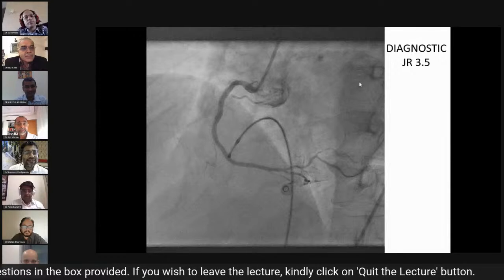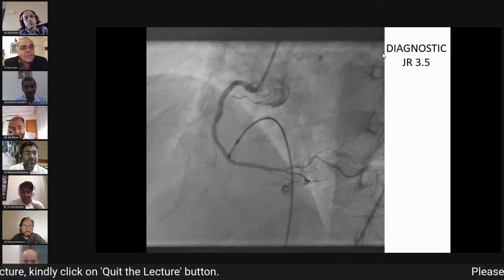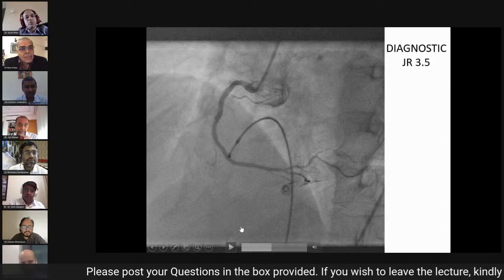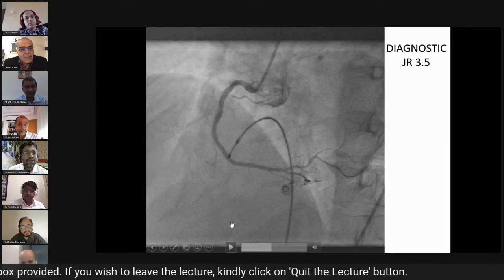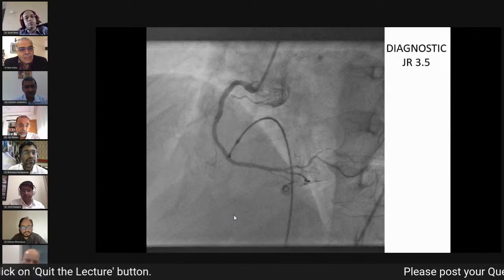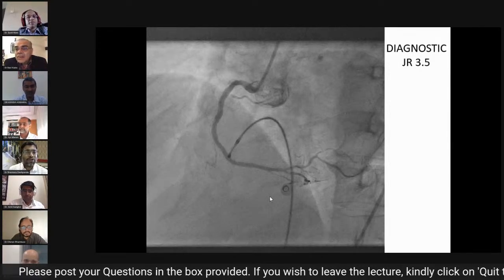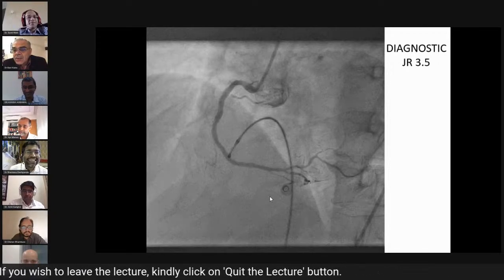Ashish, one more learning from this is that you did a great job in terms of getting the patient out. You saw that there was a little residual left behind, but in spite of using high pressure balloons, in spite of IVL that you used, the segment is stented. Remember that better is always the enemy of good. Sometimes you need to know when to retreat. Yeah. Right. Well taken, sir. Point well taken. Thank you very much. What are the chances of restenosis you have given to your patient, Ashish? Yes.